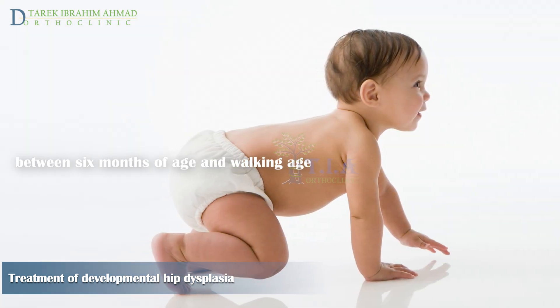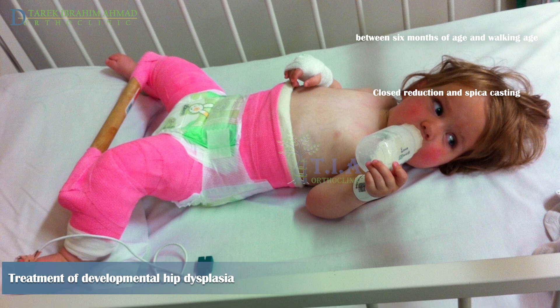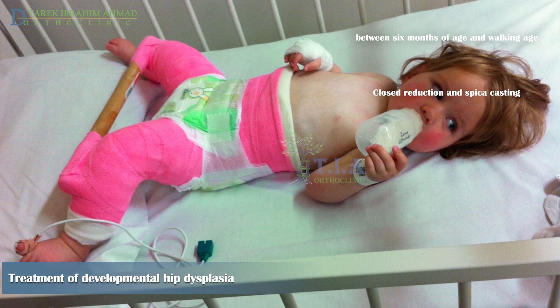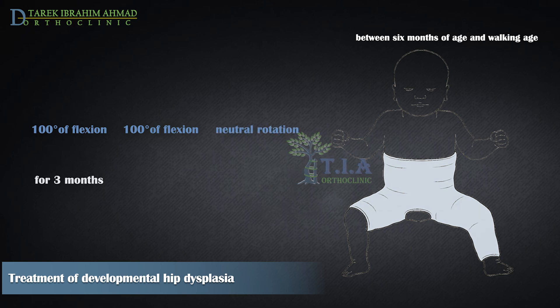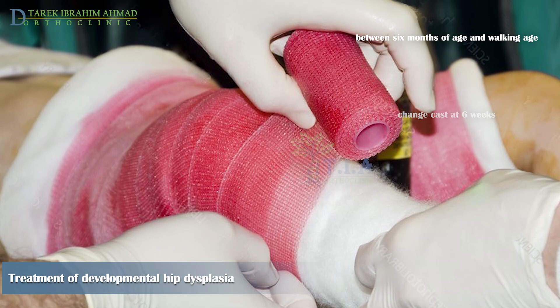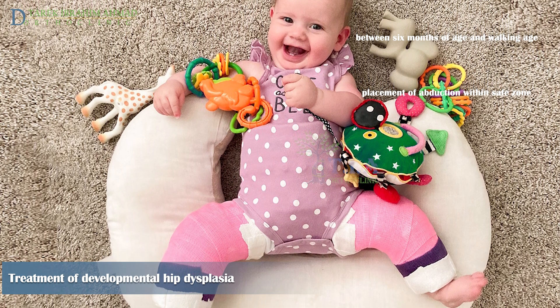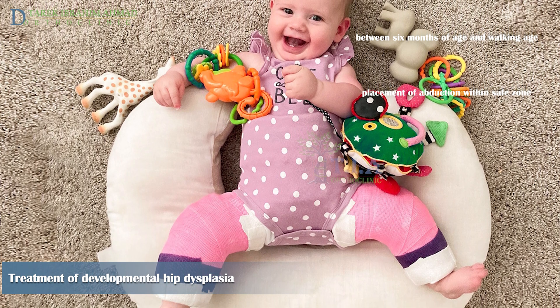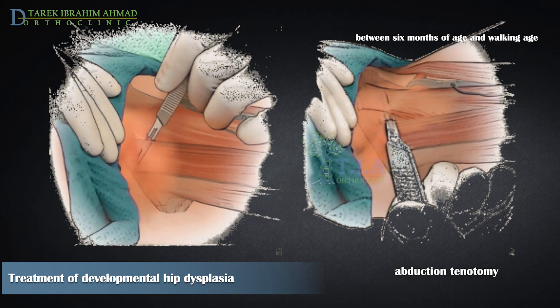For children between six months of age and walking age, most DDH cases can be treated by closed reduction and immobilization in a plaster spica cast — extending from the pelvis to the foot — under general anesthesia. The spica cast is applied at 100 degrees of hip flexion and 45 degrees of abduction with neutral rotation for three months, with cast change at six weeks. Wide abduction greater than 60 degrees must be avoided due to AVN risk, so abduction should remain within the safe zone. Percutaneous tenotomy of the hip adductor muscles may be necessary if the safe zone is unstable or excessive abduction is required to maintain reduction.